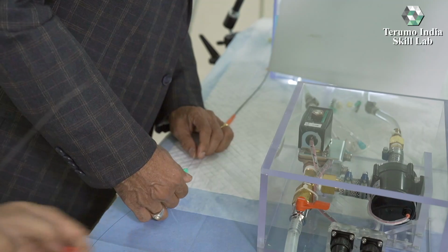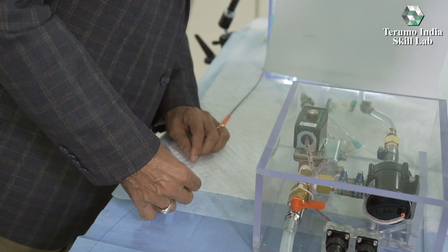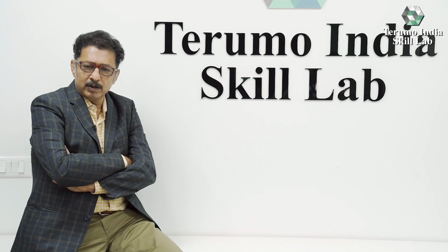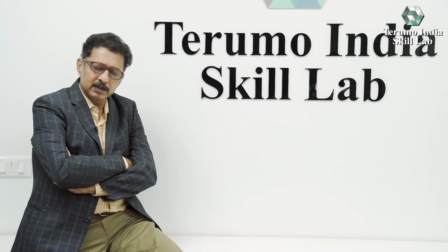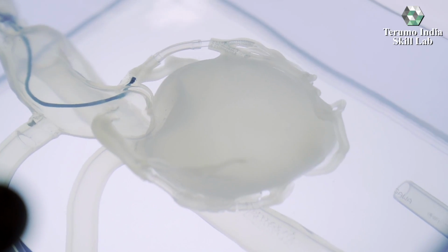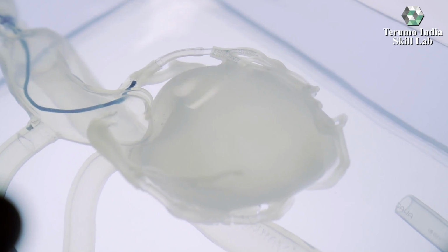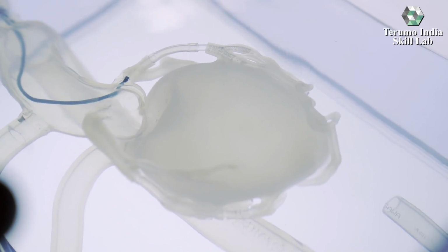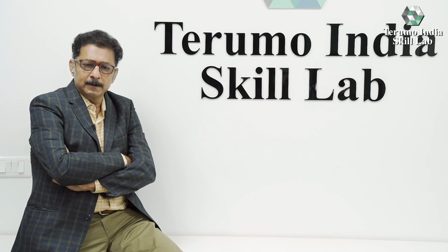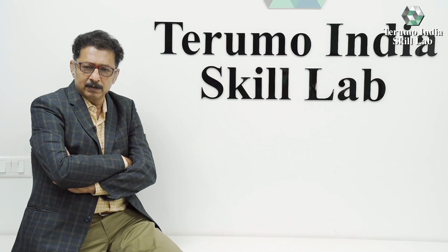All these years we have been working on static models, especially in the bifurcation club meetings that we conduct in Mumbai every year. Terumo has been kind enough to associate with us, and they were static models. We are longing to have this beating heart model. The beating heart model helps us to understand the intricacies of the influence of a cardiac cycle of a moving heart on bifurcation angioplasty, and hopefully we should be able to show you how good it is.